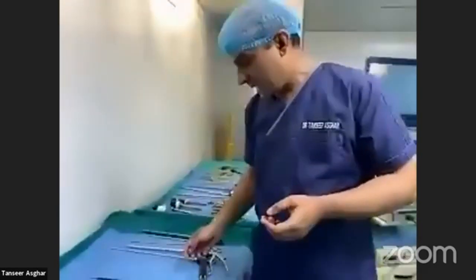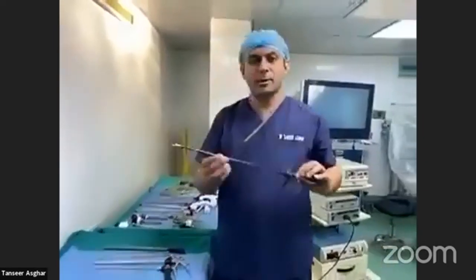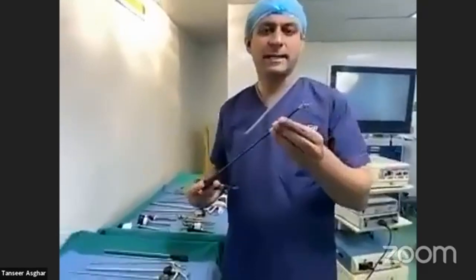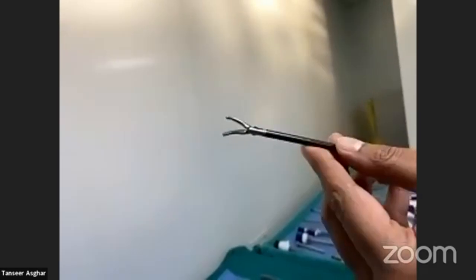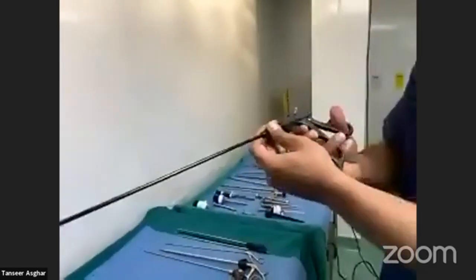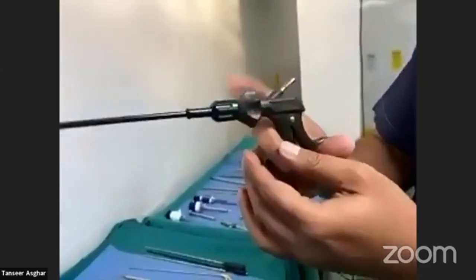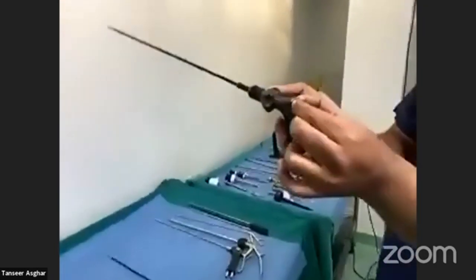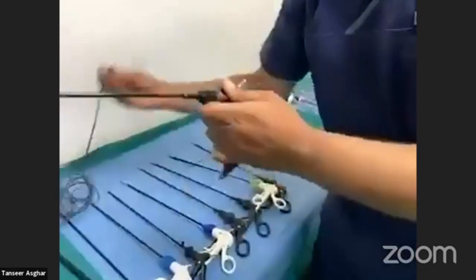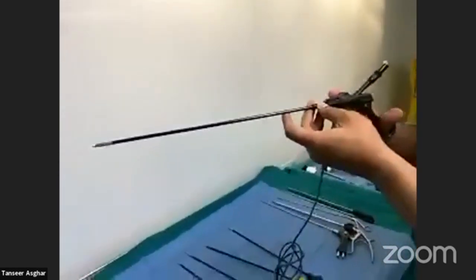Now coming on to other laparoscopic instruments used in basic laparoscopy. This instrument is called the endodissector. You can see the tip — it is just like an artery forceps, angulated in front. It is also called Maryland. It has a shaft and handle with a rotating articulating knob. There is also a metallic area where you can attach the cautery, so you can use diathermy during surgery if required.